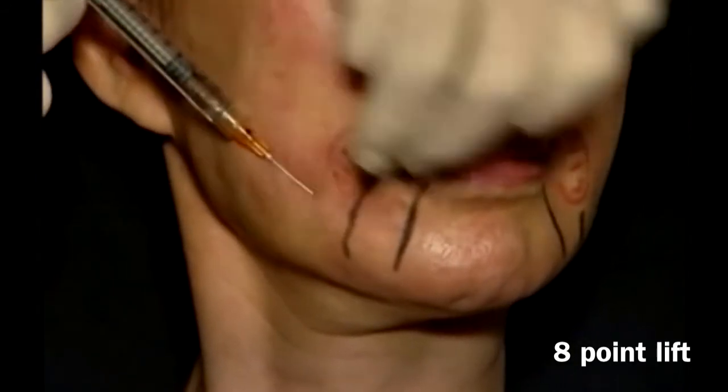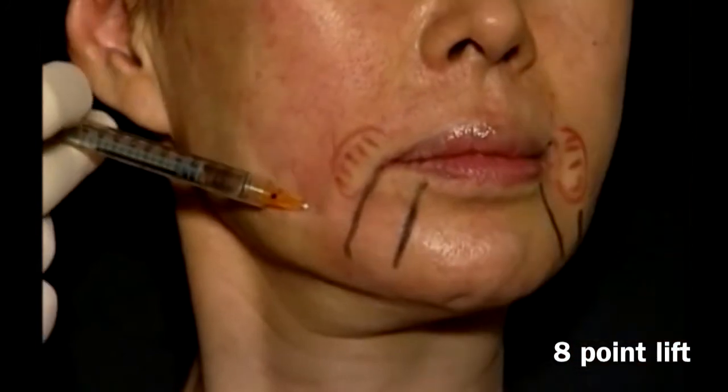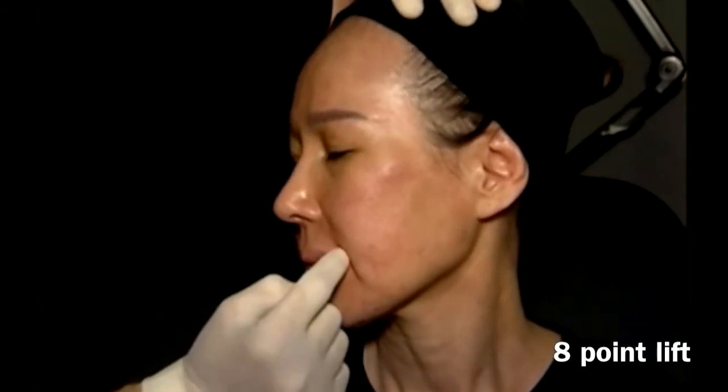So that we can give support to the more superficial areas around the perioral. We may also proceed and put the cannula in the chin, which would be point number 9. Massage, remove the markings, and evaluate the difference between the left side that was treated and the right side.